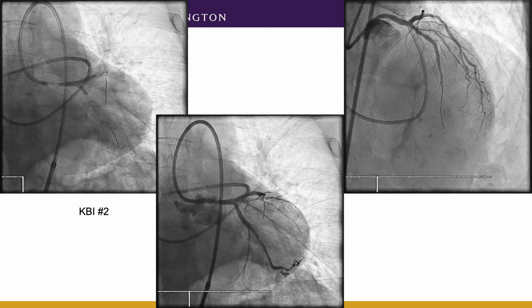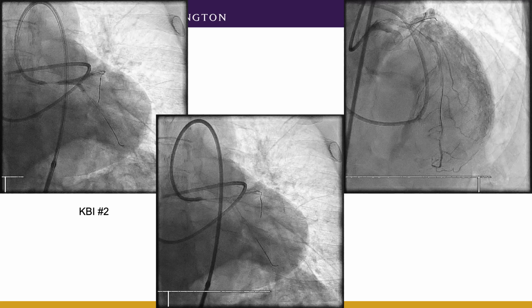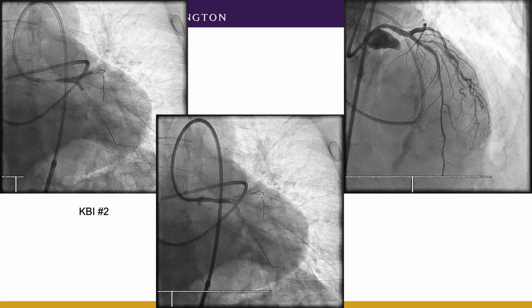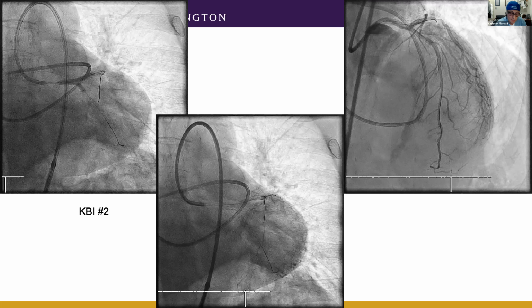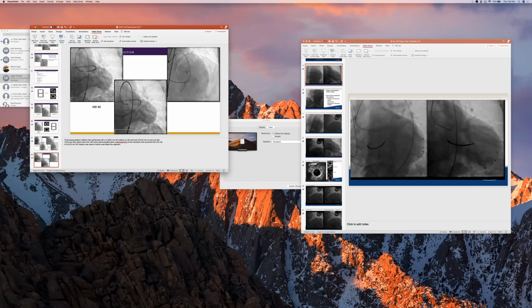But I think it's one of those where I'd be willing to leave a gap uncovered with drug too. You have a target there, and if he gets restenosis, you can deal with that and take that hit rather than overcomplicating the bifurcation. But yeah, I think reasonable people would disagree. The best strategy in this angulation would have been DK crush. They would have had to do two DK crushes, which is really painful in one patient. It's not really a good strategy. It's a long and arduous procedure. So I completely agree with your strategy, Kate.